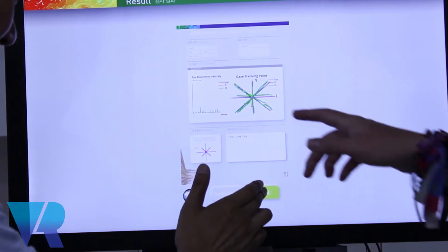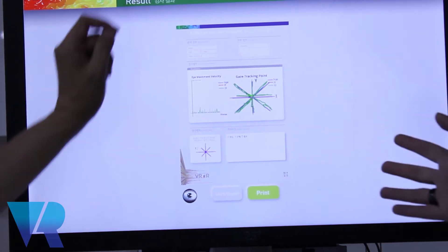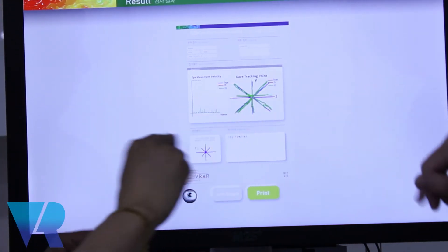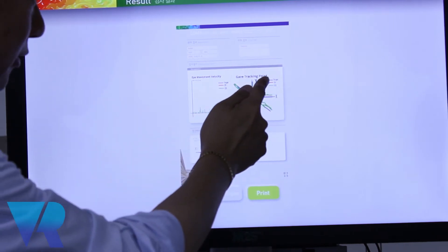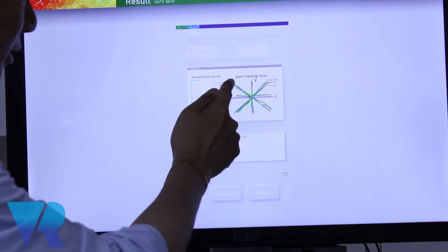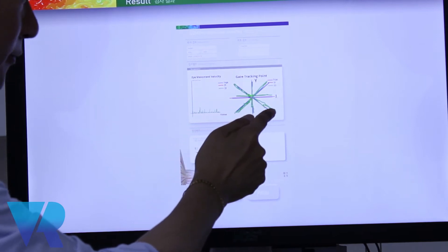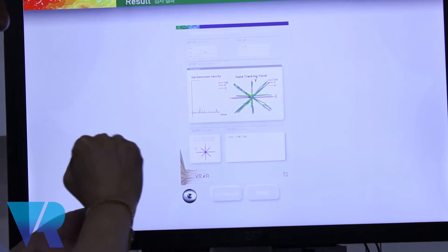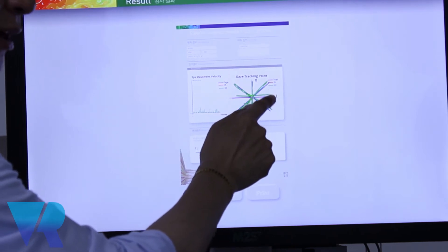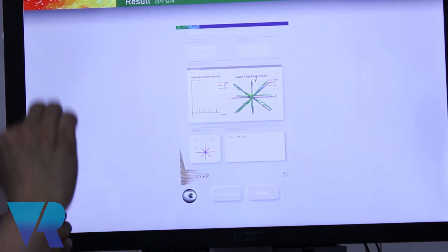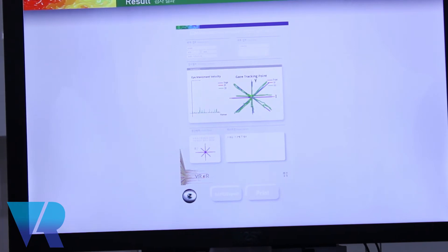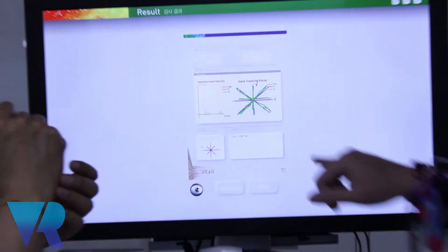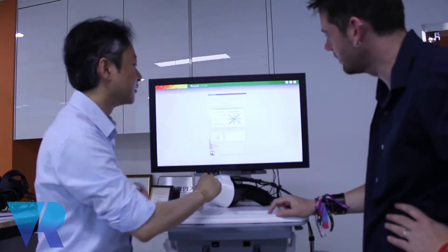So what does this mean? The blue one is the target, the target movements. Basically, the end points are most important. If your eyeball can follow all the target, then your six, there are six main eye muscles, they are moving, they are working properly.